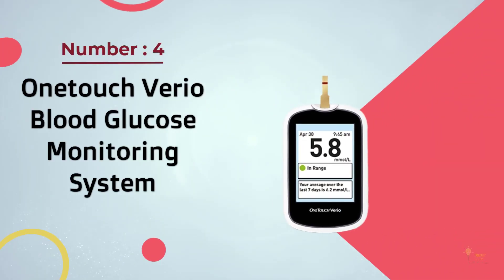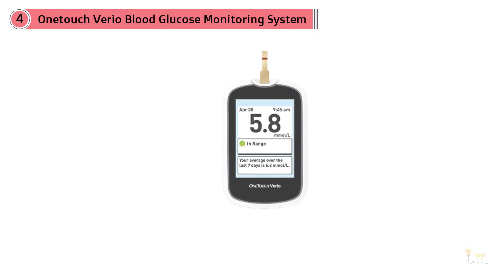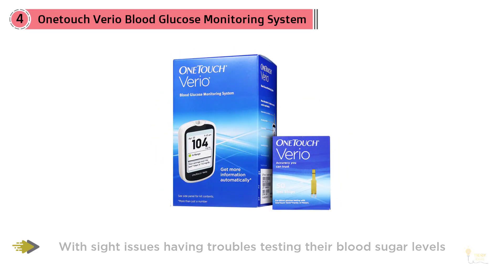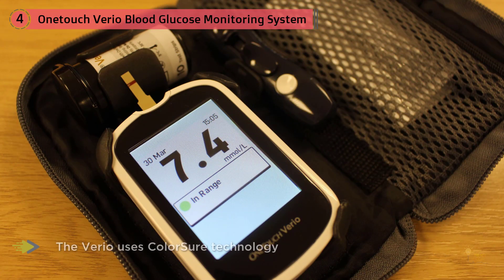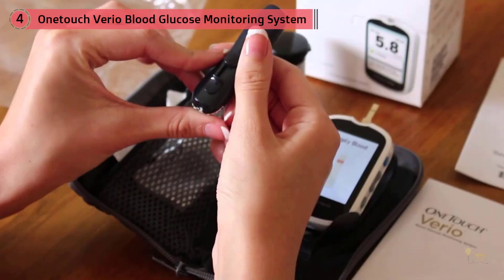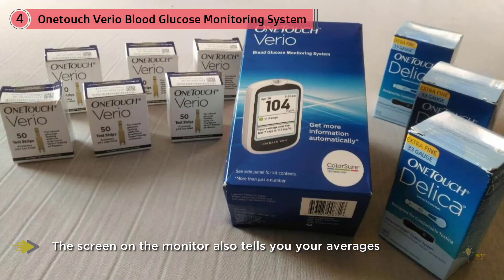Number four: OneTouch Verio blood glucose monitoring system. The OneTouch Verio glucometer is excellent for those with sight issues having trouble testing their blood sugar levels. The large backlit screen is very easy to read. The Verio uses ColorSure technology to effortlessly view a red dot meaning your reading is above average, a green dot showing your reading is within the normal range, or a blue dot indicating your blood glucose reading is below average. The screen also shows averages over the past week, two weeks, and 30 days. The OneTouch Verio holds up to 500 past test results and has been proven to be over 99% accurate.